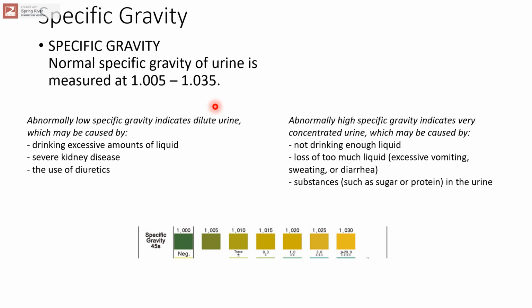Now, when the specific gravity is close to 1.001 or 1.01, it is close to the osmolarity of serum. Okay, 1.01 is close to the osmolarity of serum.